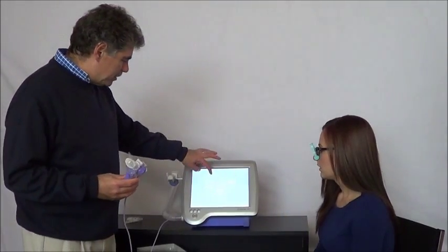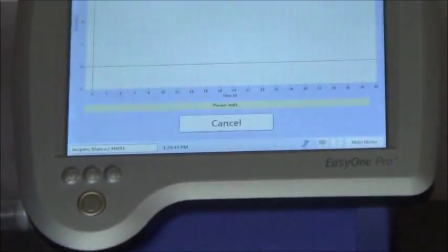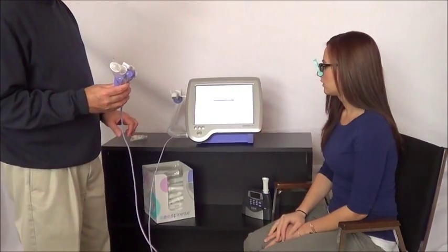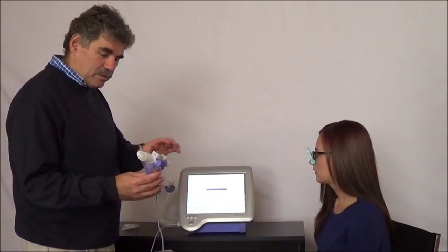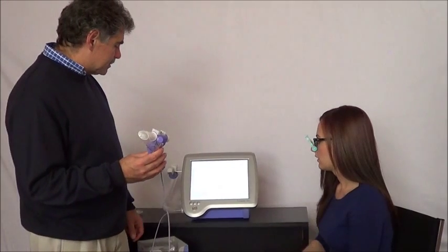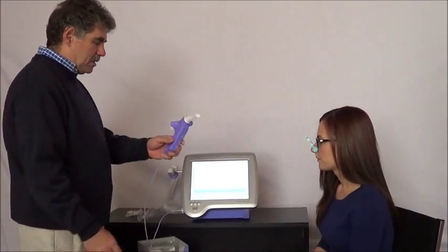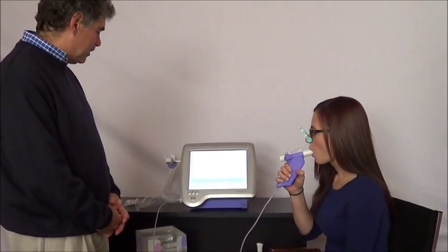From the test menu here, I'm going to choose slow vital capacity or SVC. The first step is to block the spiret until prompted — that's so I can set the baseline, which is why I left the bag on there. I'm already blocked, so I'll say okay, and in a few seconds it's going to tell me it's ready to go. Start test — so I'm going to gently remove the bag and ask Bianca to put the mouthpiece in and breathe normally.